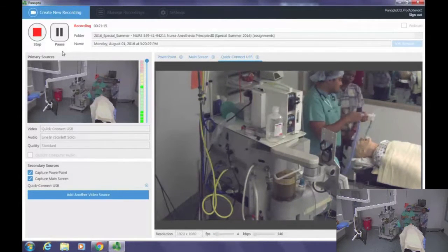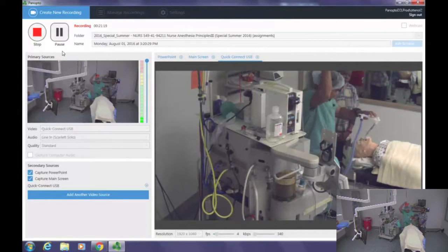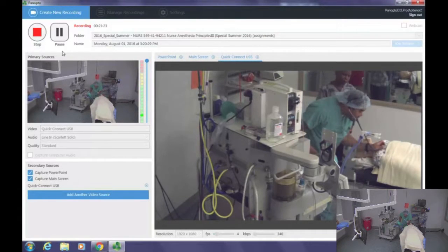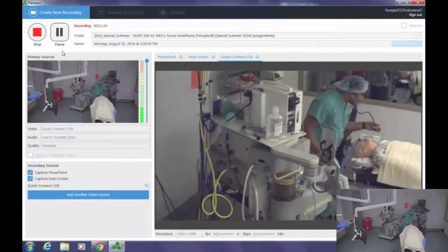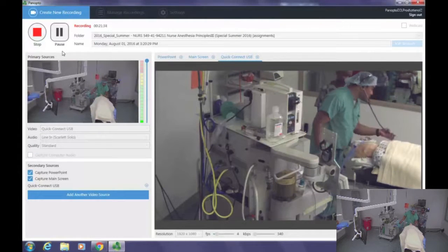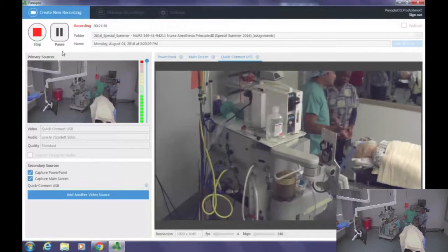First, you clamp the left side for the left bronchial tube, all right? And you could listen to the lungs and see whether you could hear breath sounds on the right side. And then you listen here, there shouldn't be any breath sounds on the left because you clamped the left tube.